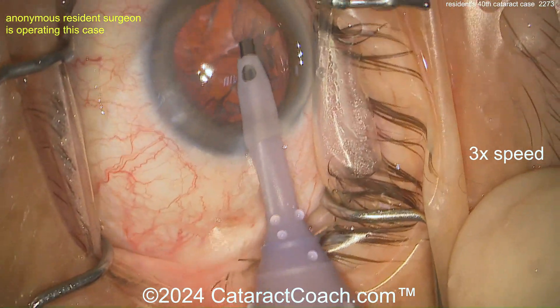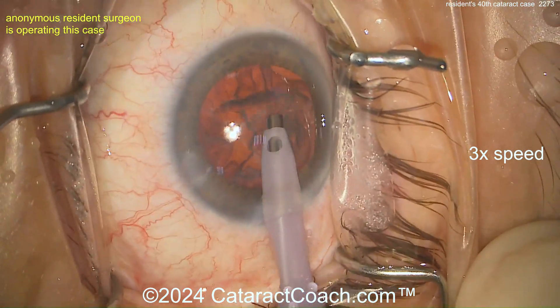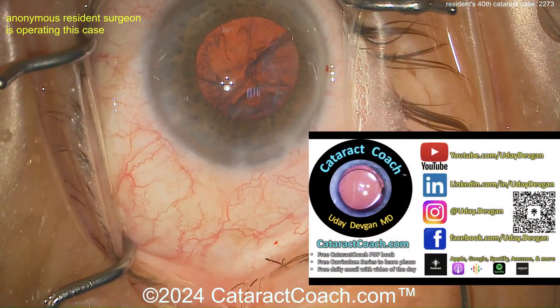Remember, the view from the camera is much less than the view through your ocular. Better back and in primary position — get these last few pieces out. I actually like having a chopper in the eye to help with those last pieces.